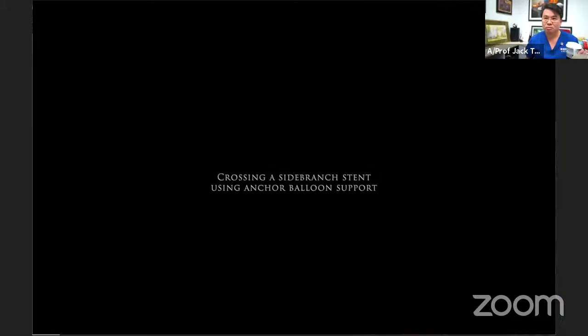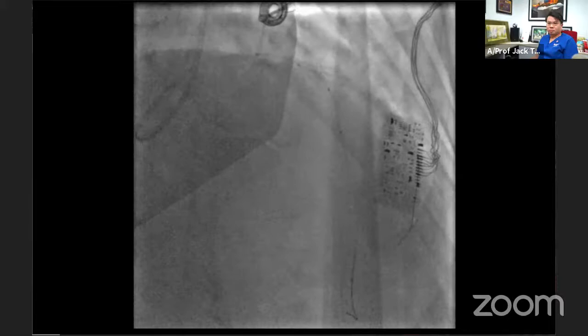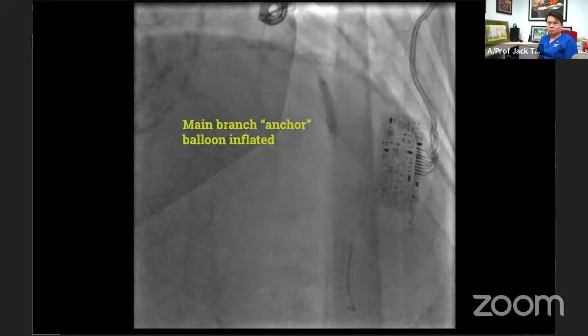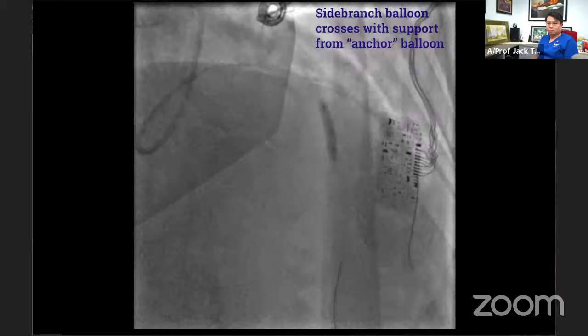Here we have a situation where we have a crushed side branch stent marked by the white arrow and a balloon marked by the red arrow that we're trying to cross with. We're not able to do so, and we place an anchor balloon in the main branch stent marked by the yellow arrow. We're going to inflate this and use this to support the apparatus that allows crossing into the side branch. This technique can be used in any bifurcation technique, be it Culotte or DK crush. As you see over here, the main branch balloon is now inflated. And now, with some effort, that previously uncrossable balloon is able to make its way into the side branch stent, allowing you to complete the procedure.